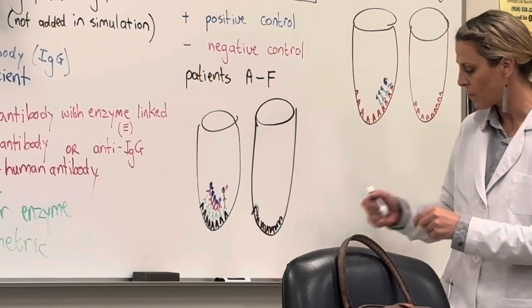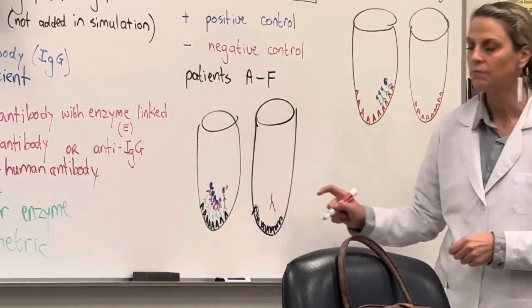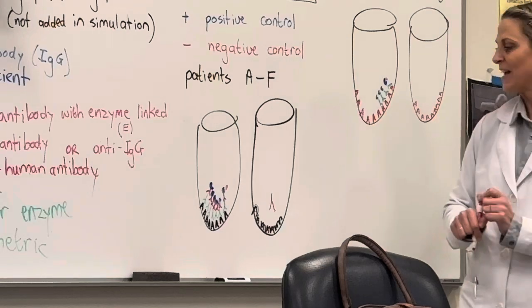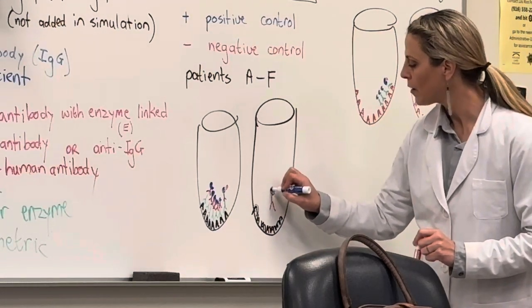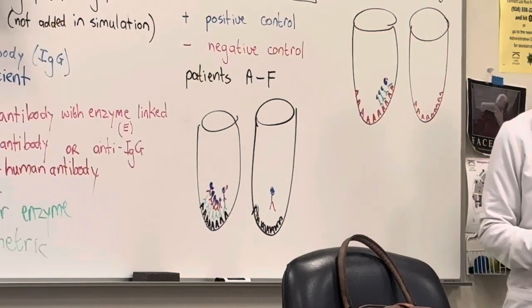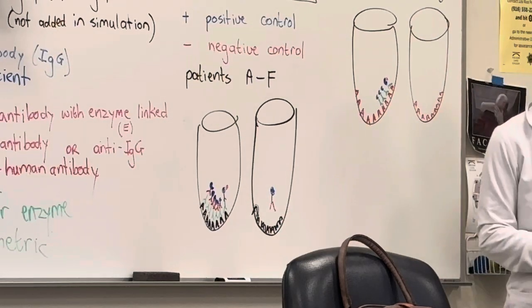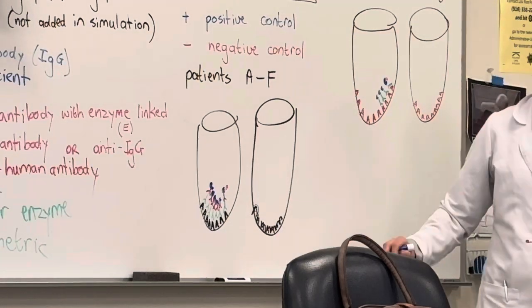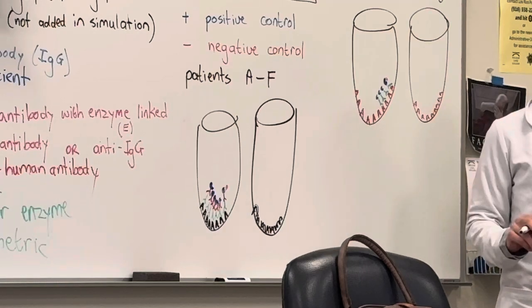So now we're going to add the antibody. Okay, so here, but they're not going to stick to anything, because there's nothing for them to stick to. They don't recognize any antibodies. So we wash that out. We add the chromogen, it does nothing because there's no enzymes in there. Our patient's negative.